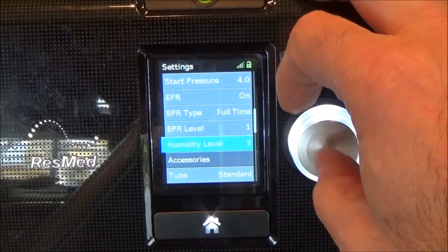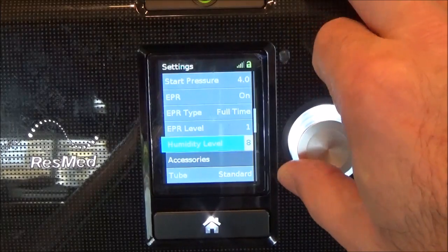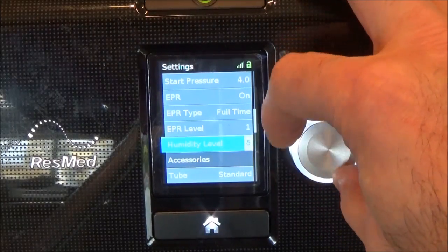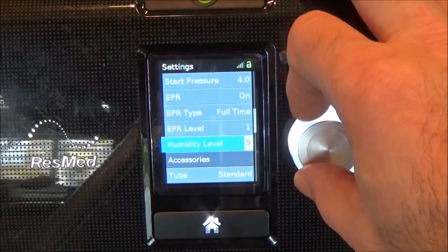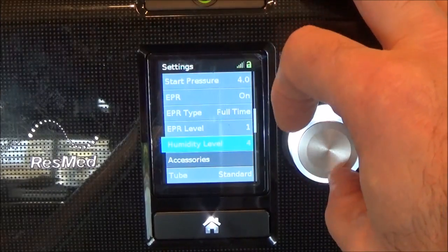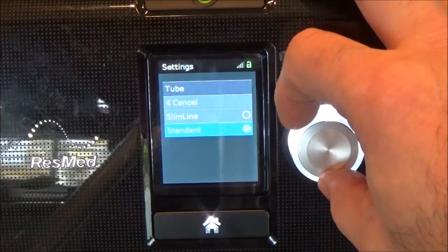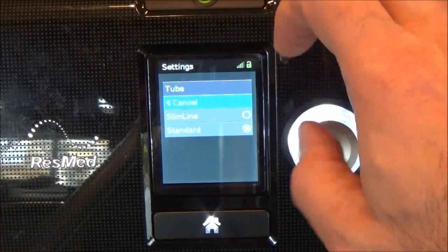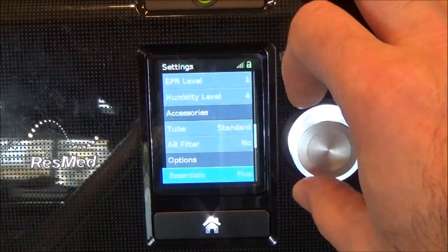Now you have the humidity level of your humidifier — it goes up pretty high. Just start mid-range, three or four, to get started if you're new to this, and adjust from there. What kind of tubing? Standard, or you do have the slimline heated tubing. Whatever you have, enter that so it enables everything.